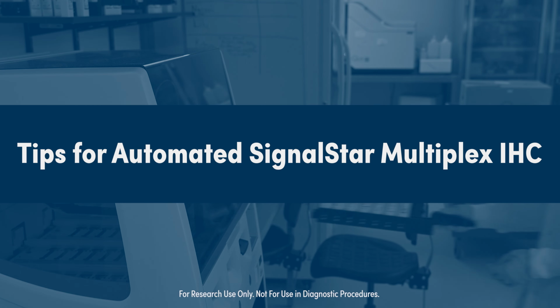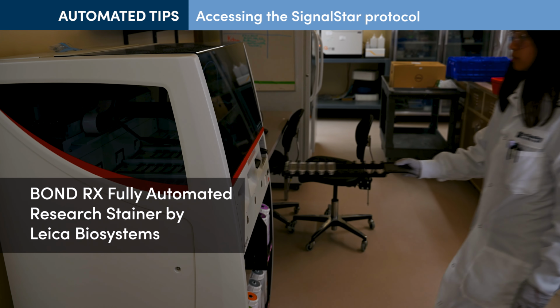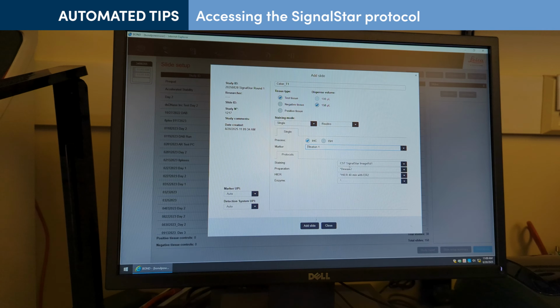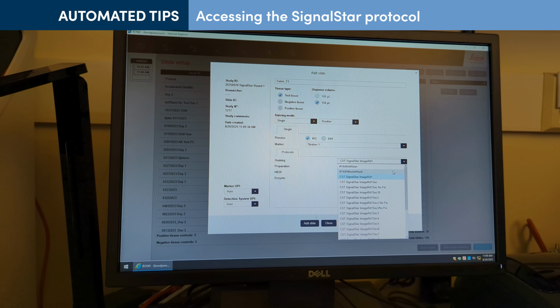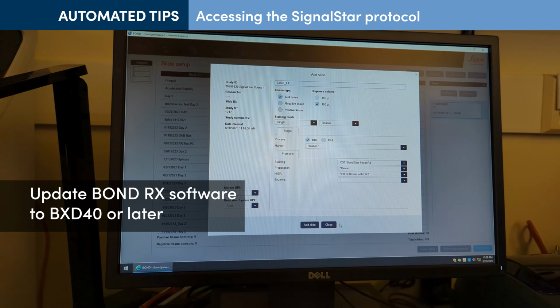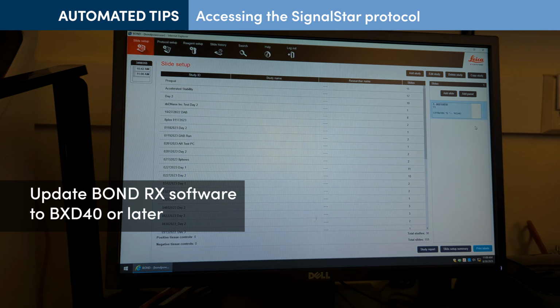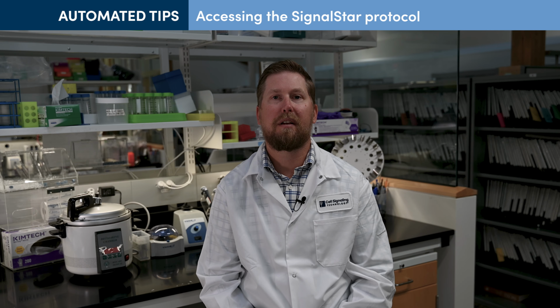Now, let's take a closer look at automated staining. Scientists on the Multiplex Assays team at CST validate SignalStar kits and products using the Leica Bond RX system. So, if you have access to this autostainer, you can follow the SignalStar protocol directly by selecting it in the Bond RX drop-down menu. If you don't see the SignalStar protocol there, be sure to check that the Bond software is updated to BXD40 or later. For other automated IHC systems, it may be possible to adapt this protocol. Please contact our team via the technical support link if you have questions about the automated protocol for your instrument.